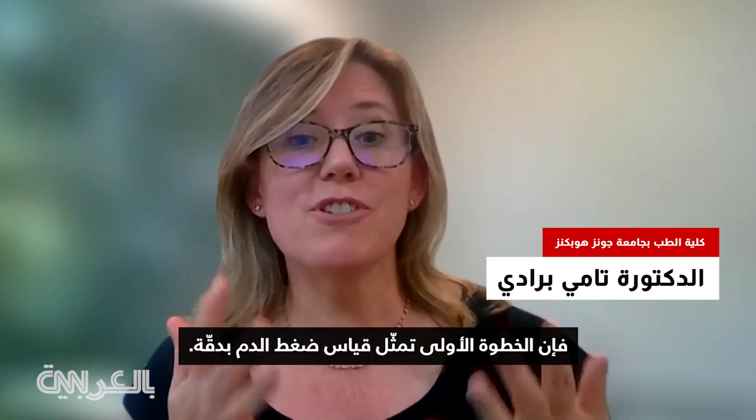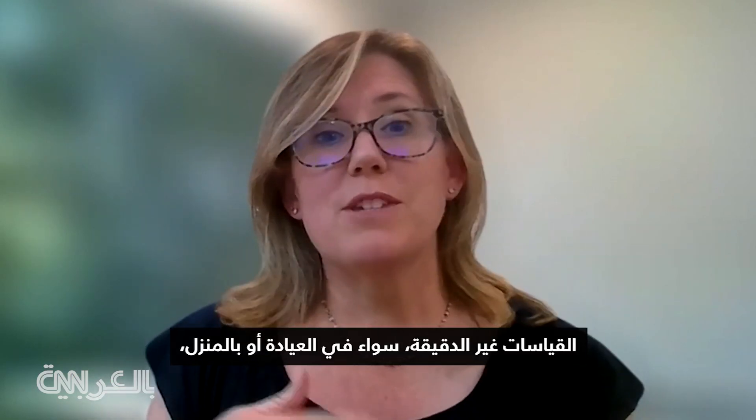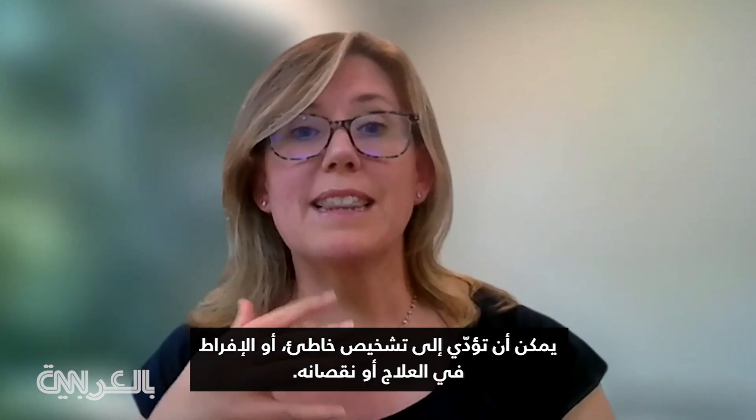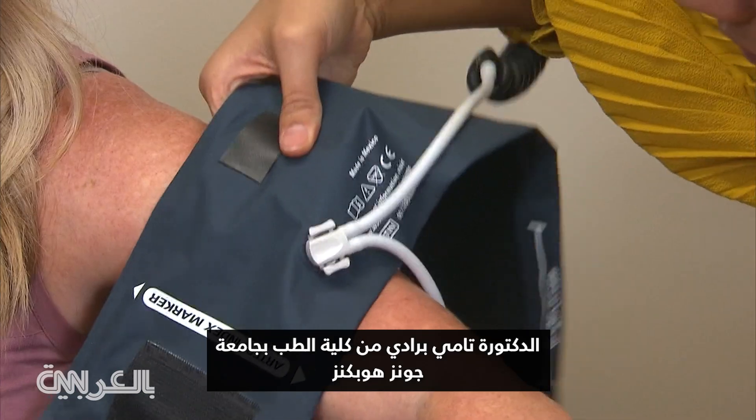In order to diagnose hypertension, the first step is getting an accurate blood pressure measurement. Inaccurate measurements, whether in the clinic or in the home, can lead to misdiagnosis or either over or under treatment.